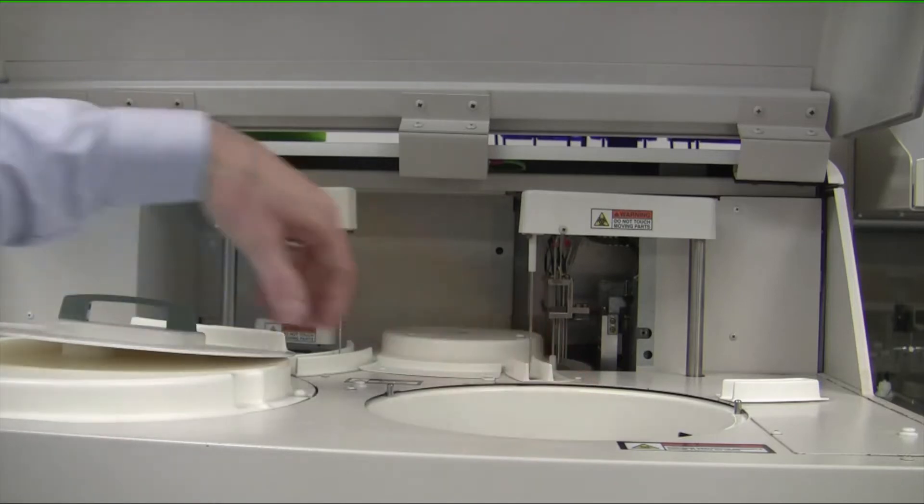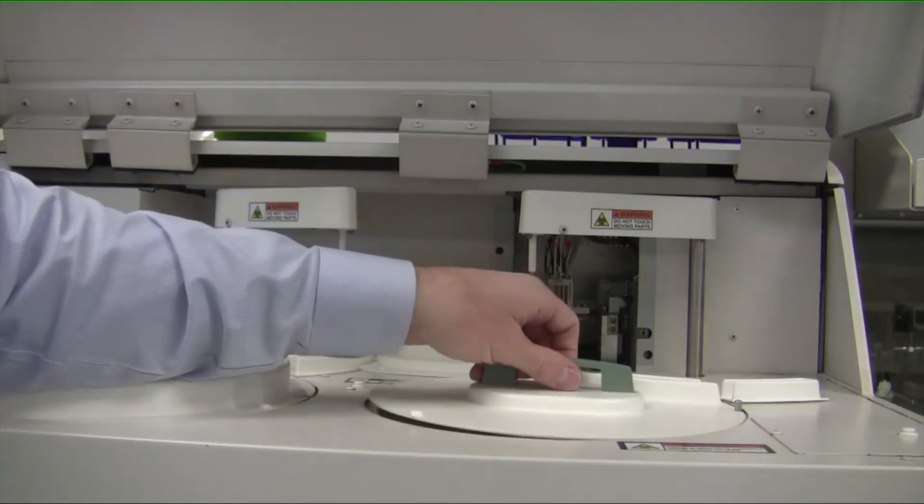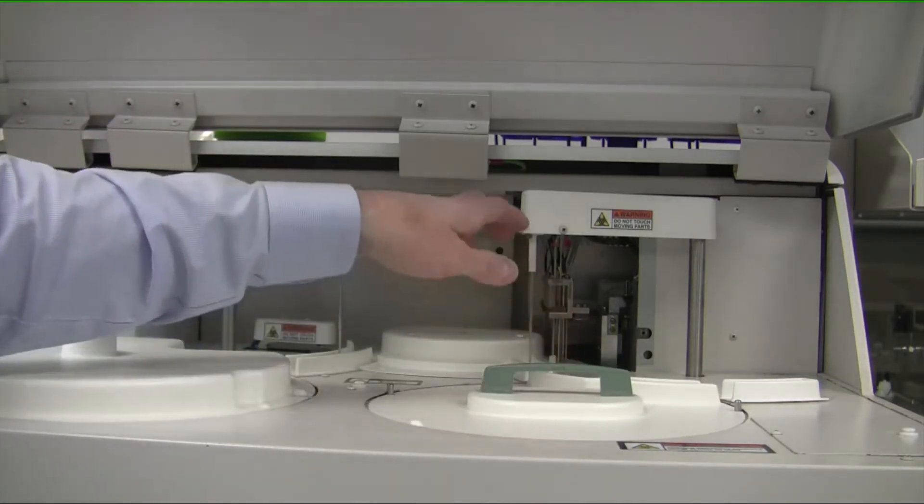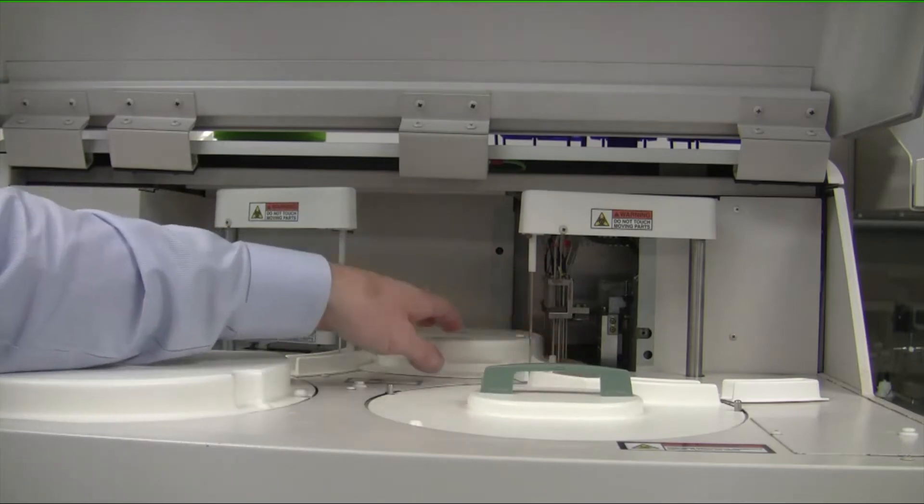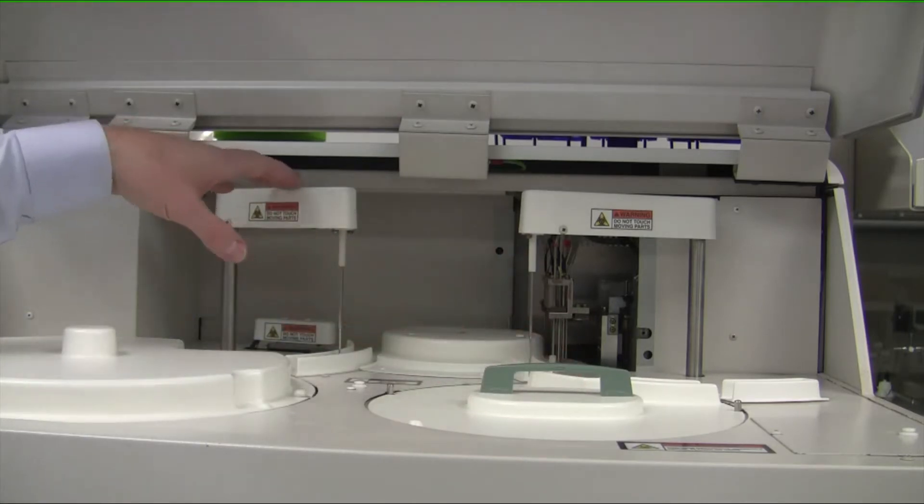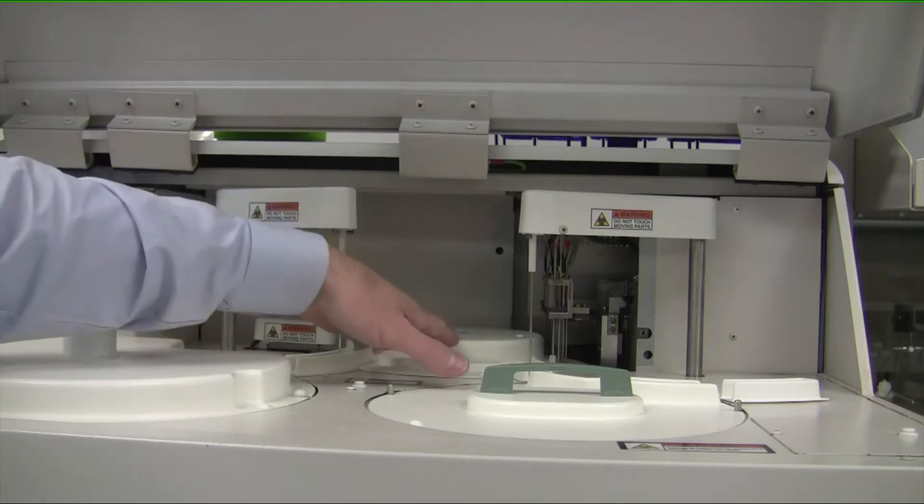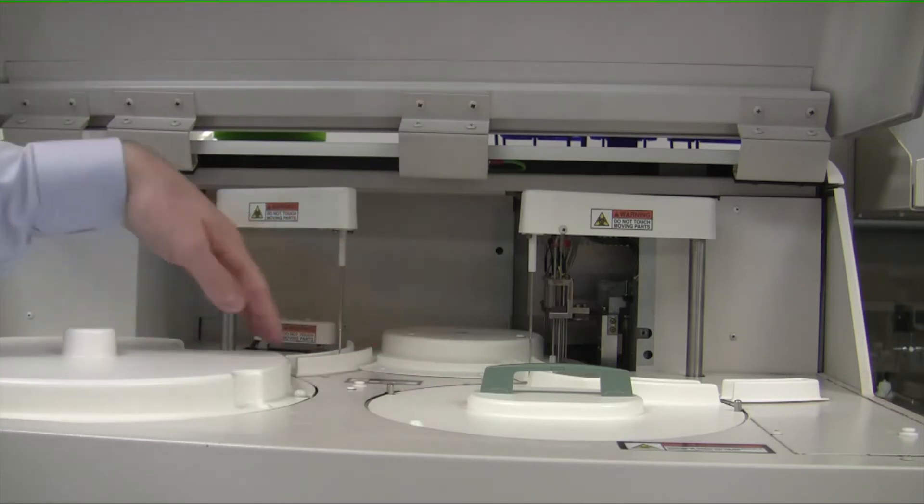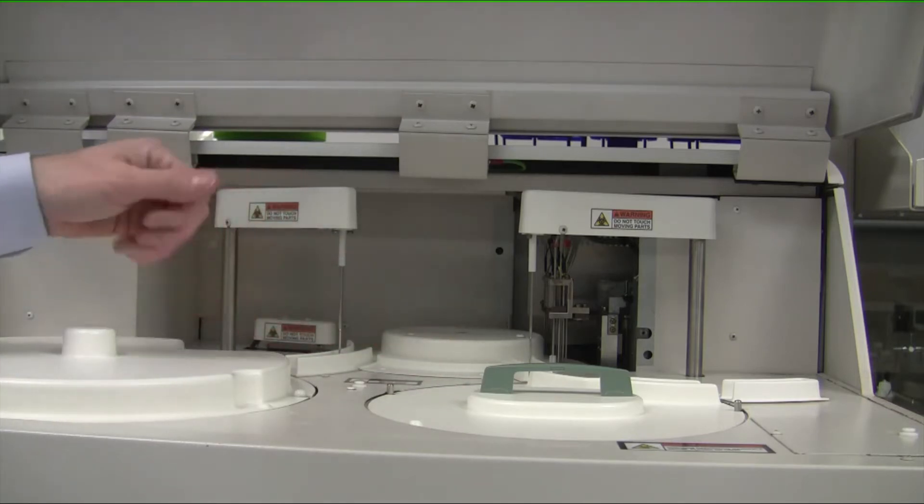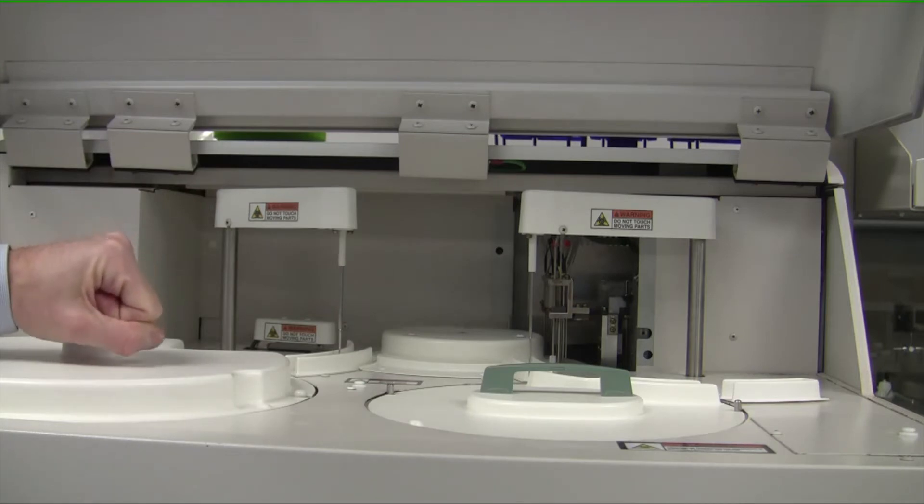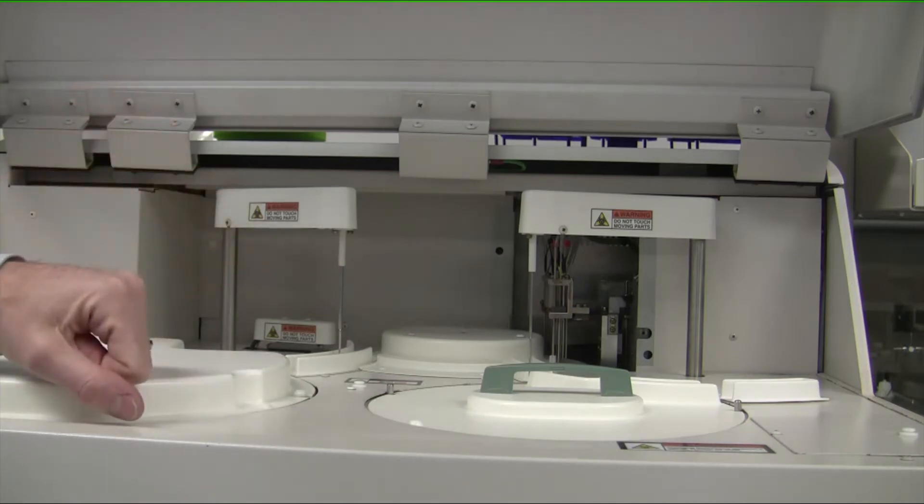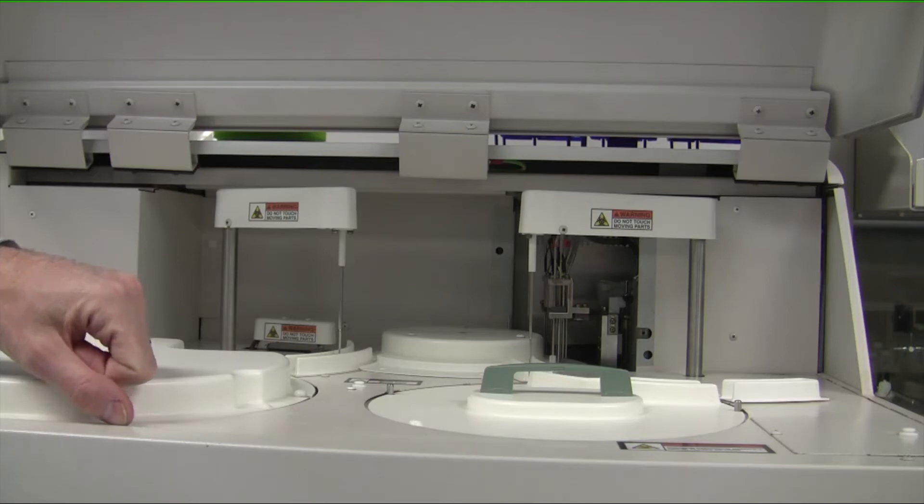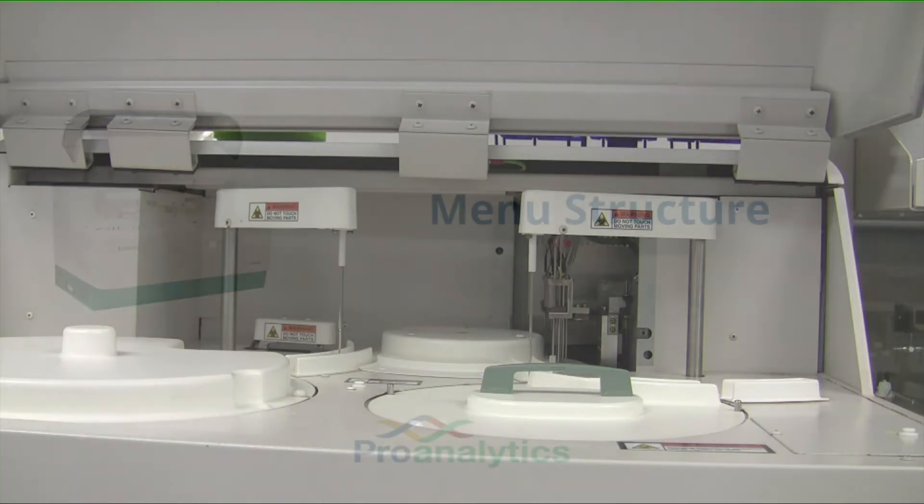So when we run the instrument, this first pipetter is going to pick up a little bit of sample and put it into a cuvette. The second pipetter is going to pick up a little bit of reagent and put it into the cuvette. The mixer is going to mix the cuvette. An enzymatic reaction occurs creating a color, and then that color is measured and correlated very accurately to a specific metabolite concentration.